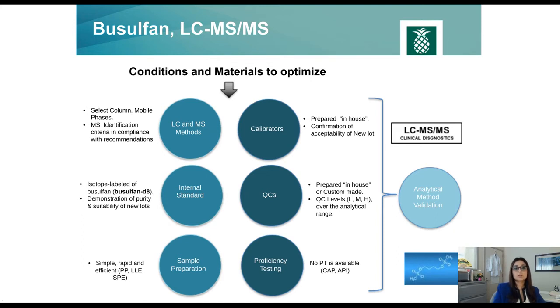Use an isotope label of busulfan as internal standard to control variation in recovery, matrix effects, and ionization. Choose a sample preparation procedure according to the volume of samples, the matrix effects, and analyte recovery results obtained during the validation.